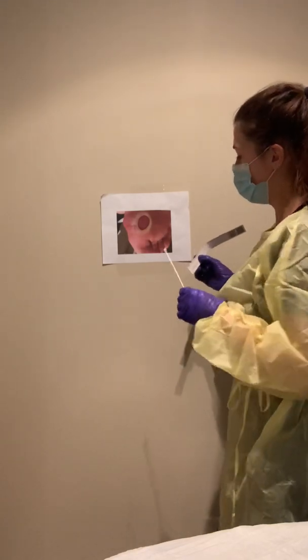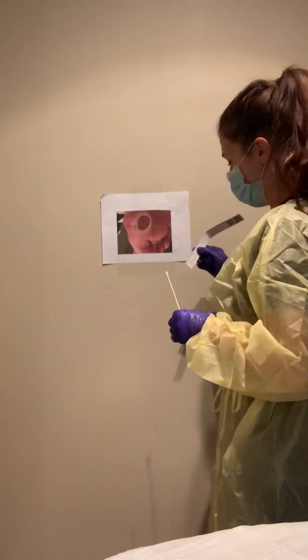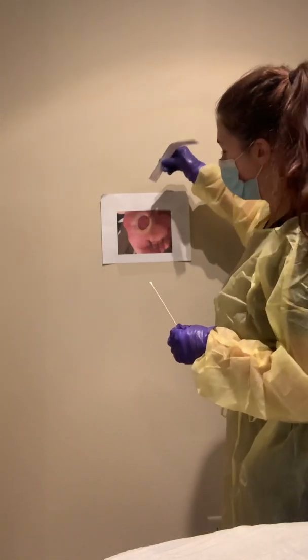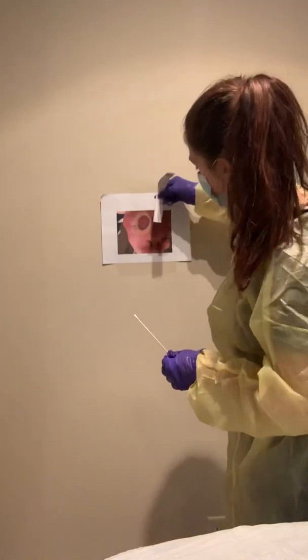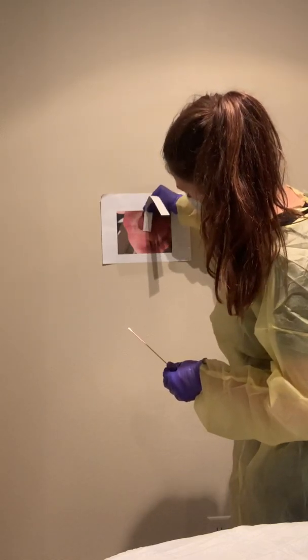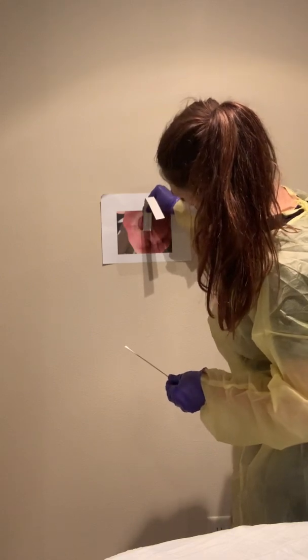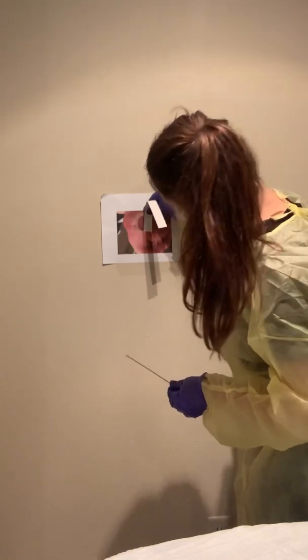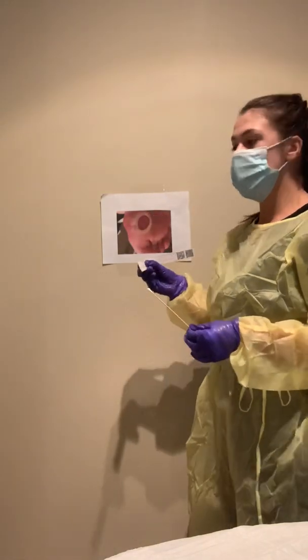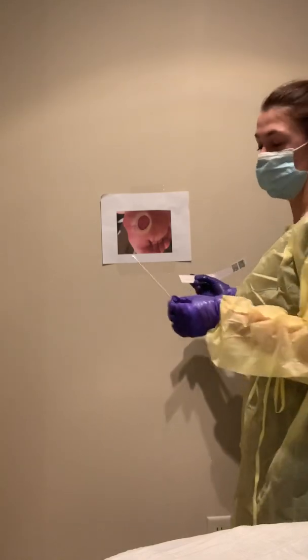To do this, the wound is already currently in good anatomical direction. So we have 12 o'clock and we have 6 o'clock. I'm gonna take the measurement from 12 to 6 o'clock on the wound. So I'm gonna go ahead and find the edge of the wound at that 6 o'clock position, run it directly vertical to the 12 o'clock position, and that will give me 4.5 centimeters.